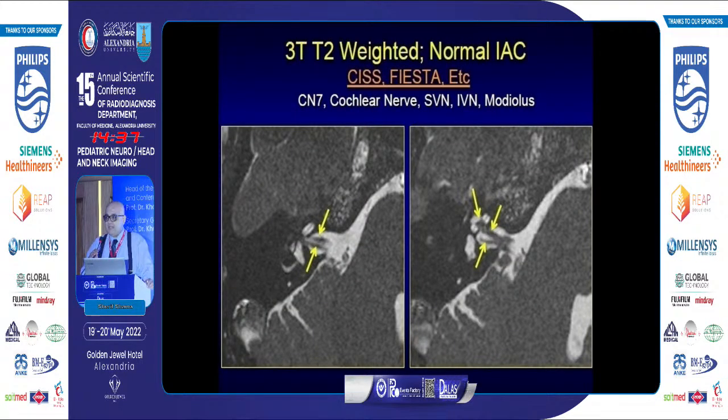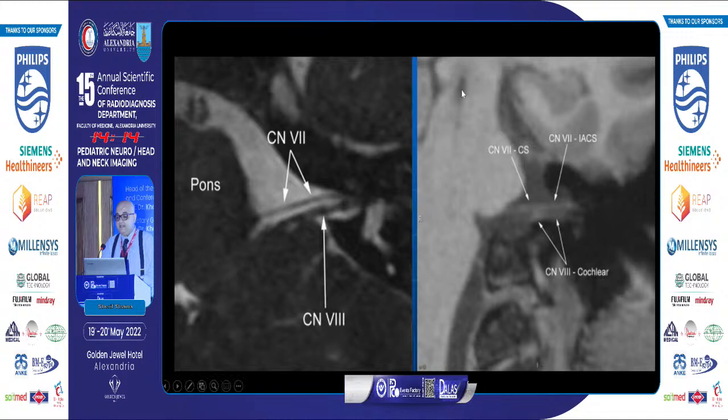When we use a 3 Tesla scanner, going from above downward, there are two parallel lines representing the facial nerve and the superior vestibular nerve in the superior compartment of the canal. In the inferior compartment, we have two divergent lines — the cochlear nerve and the inferior vestibular nerve. On axial and sagittal oblique views, the facial nerve is superior, then the cochlear nerve is inferior.